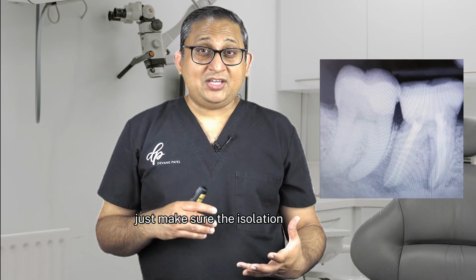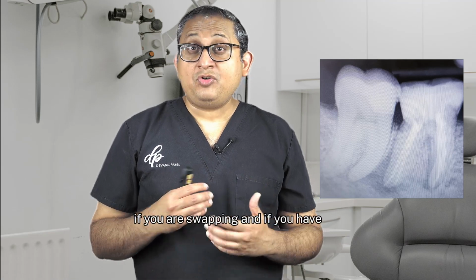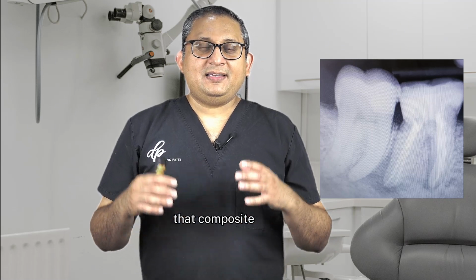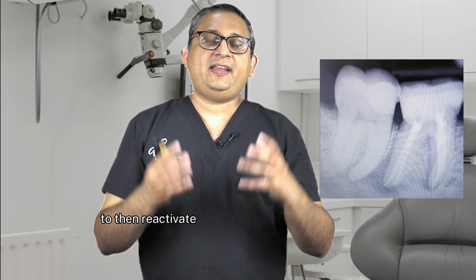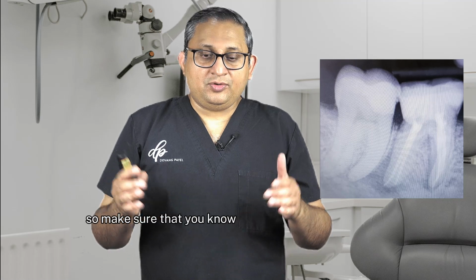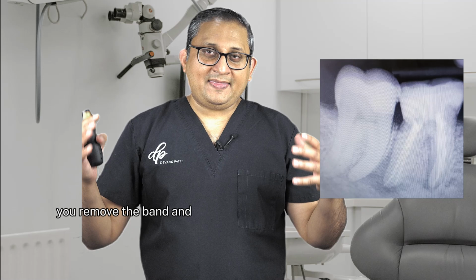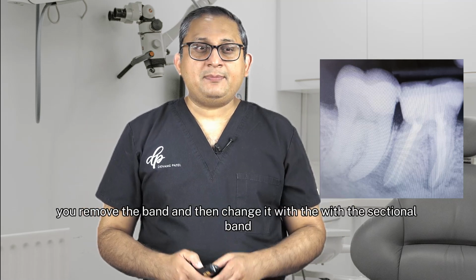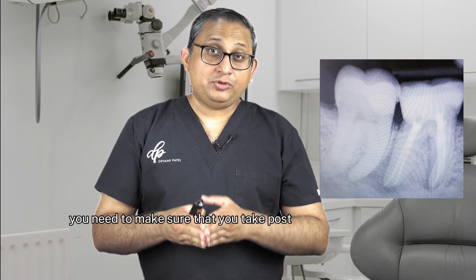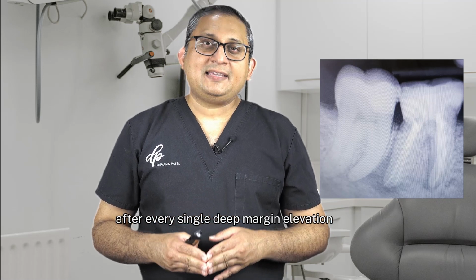Just make sure the isolation is the king. If you are swapping and if you have not used a rubber dam and the area gets contaminated, it's a faff to then reactivate the composite and redo the bond and everything like that. So make sure that it's nicely isolated before you remove the band and then change it with the sectional band. But this is really important. You need to make sure that you take post-operative radiograph after every single deep margin elevation case.